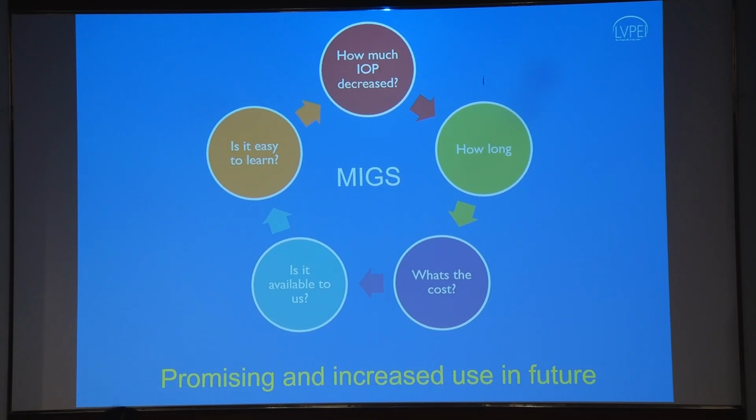So to end with, I would like to just have this picture, like how much IOP is decreased. At present, what we achieve is around 25 to 30% of intraocular pressure reduction. How long? It's too early to say. With 6 months to 12 months of follow-up, we have seen patients maintaining that intraocular pressure reduction. The cost: obviously the GAT procedure is minimal cost, only the cost of the 5-0 Prolene suture; the surgical gonio lens is autoclavable, and the forceps is autoclavable.